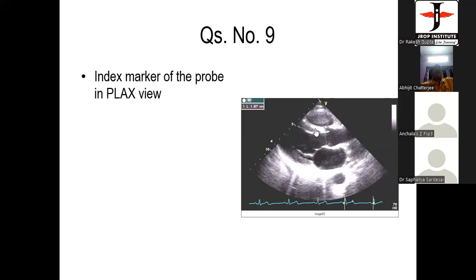Now, doctor, remember that if you see the annulus, all the structures that are to the left of the annulus are measured in systole. All the structures that are to the right of the annulus are measured in diastole. Would you remember that, please? Yes, sir. See, this is what I mean. The annulus is measured in systole. The LVOT is measured in systole, mid-systole. The other structures, that is the sinus of Valsalva, the sinotubular junction, and the proximal ascending aorta, are measured in diastole. Will you remember that, please?